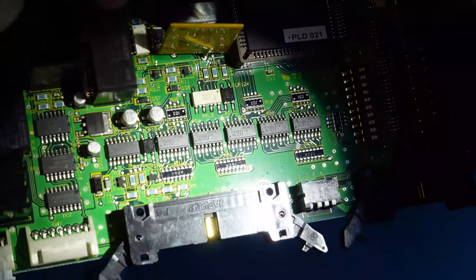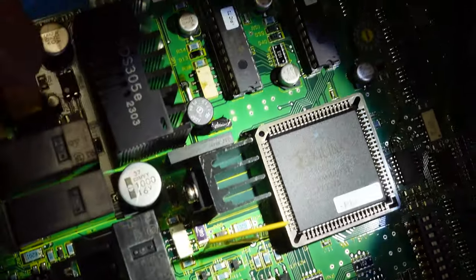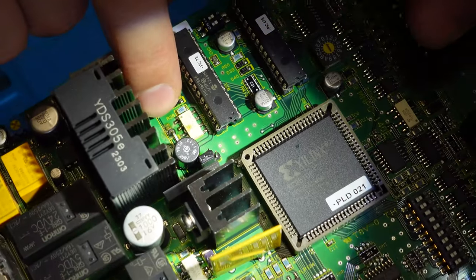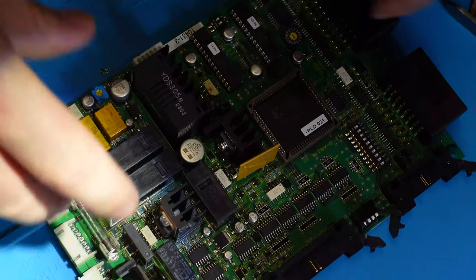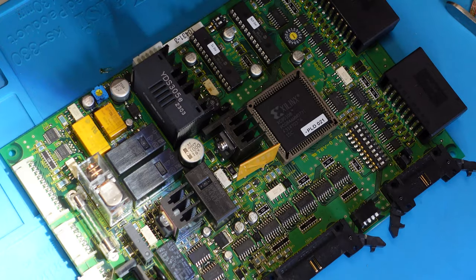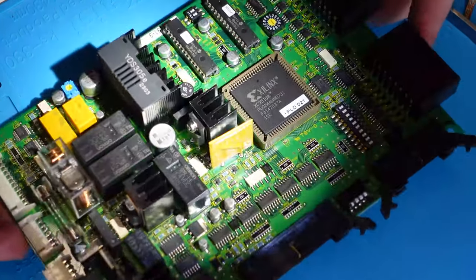So the new chip is in, right here. The new fuse is in, right here, and the little brown spots you see, that's flux. And now all I gotta do is go ahead and clean that flux away with a cotton swab and some rubbing alcohol. And this board is ready to go.